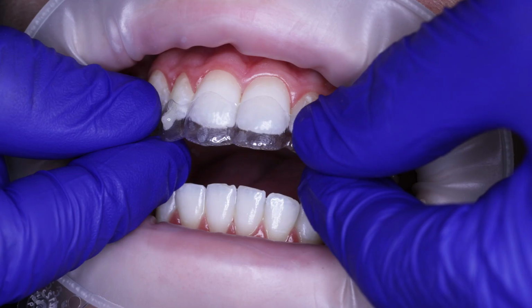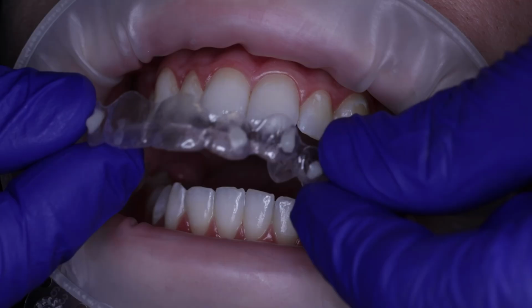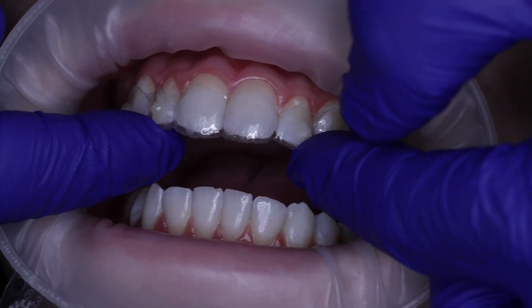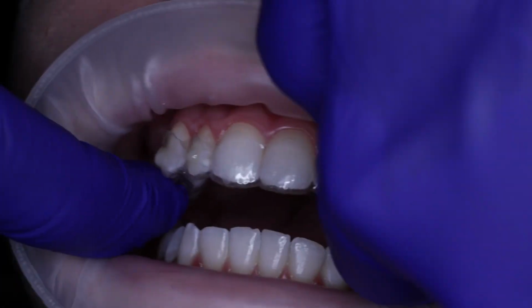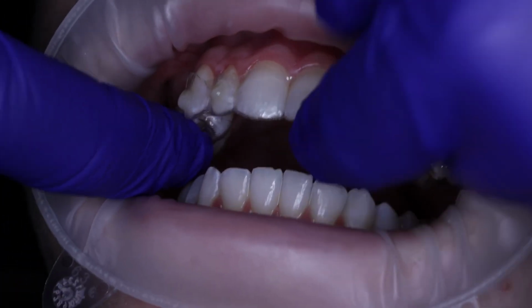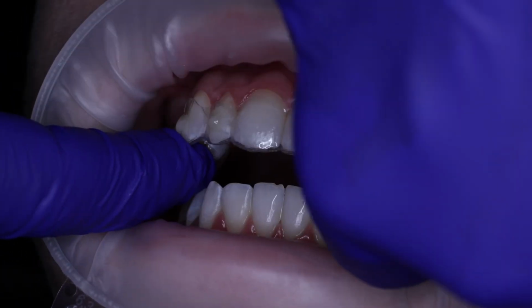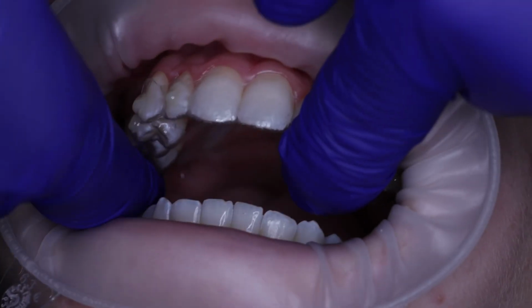Now I am actually going to back up and I want to just show you this again. When we are loading the template and acid etching, we've done our bonding agent, we've placed our composites in the template, we're going to seat it all the way down. When we seat it, we want to make sure we see no daylight. That's what we call a big space in between where the tooth and the aligner go in. We want it down all the way.